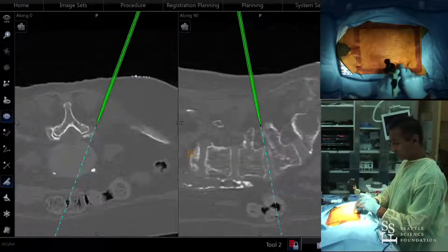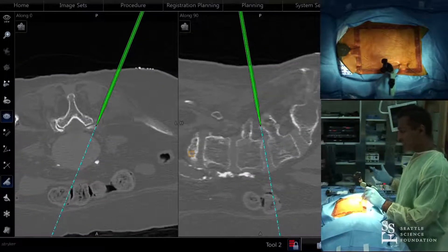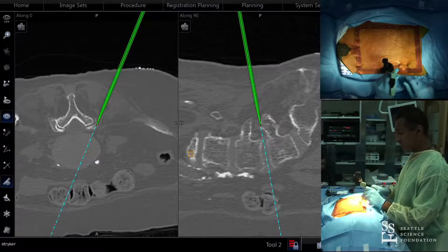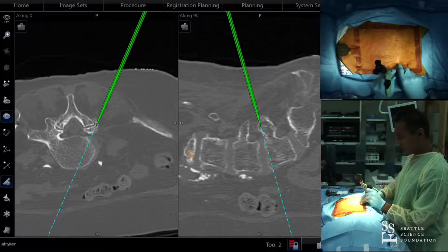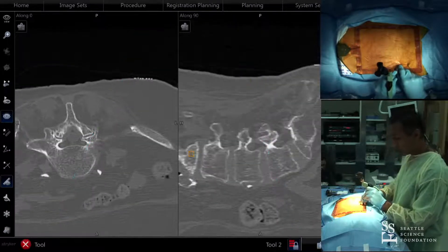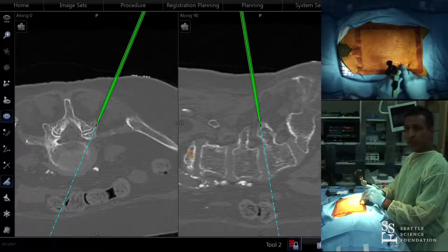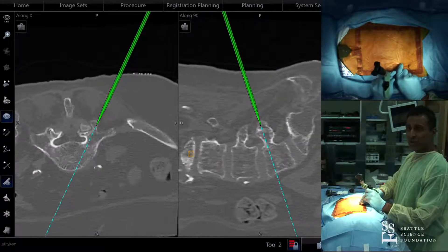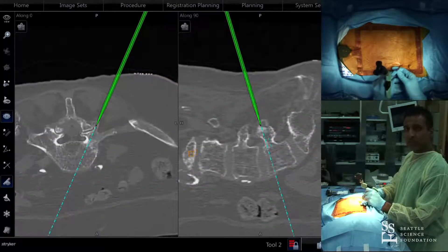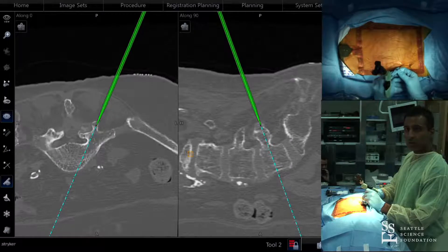You're able to do a significant portion of your work navigated, but some things are non-navigatable — like when my colleague comes in to pass the rod and put down the end caps. Those steps require a C-arm. Being able to not have to change out machines can be pretty helpful.